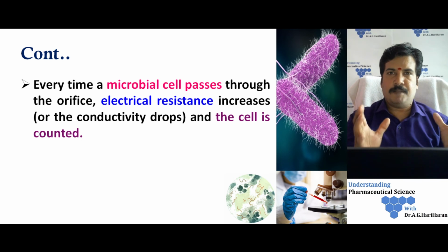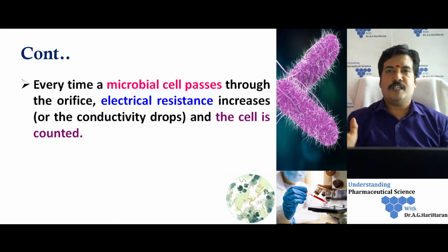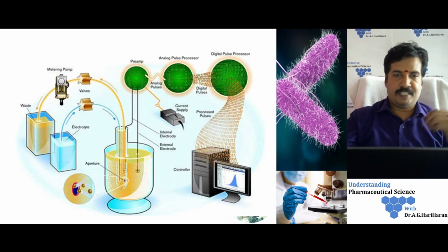So this is the simple way it works. The work is very simple: fill the sample in the outer chamber and switch on the machine, so that once it withdraws, the movement of each cell will be counted and amplified. I have shown this in the picture.